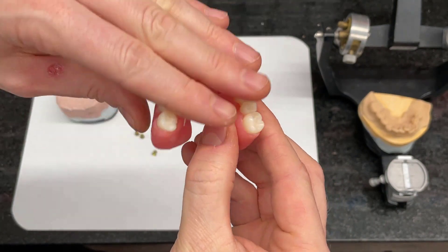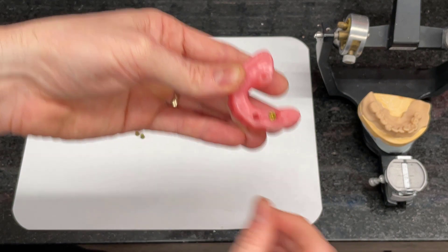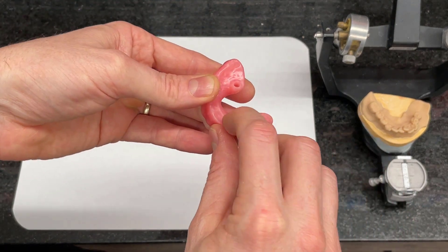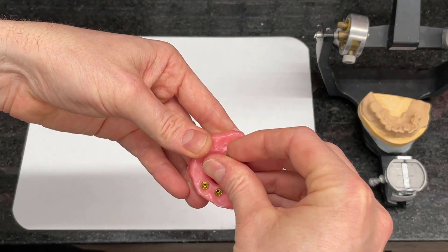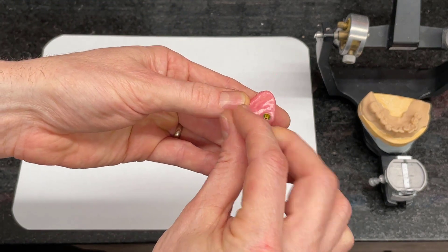As you can see here as I start to fit the teeth together, the tie bases from DES drop right into the milled out intaglio surface of the All-N-X restoration. Designed in the software and brought into my R5, this is the denture base straight out of the R5 just with the sprues removed.